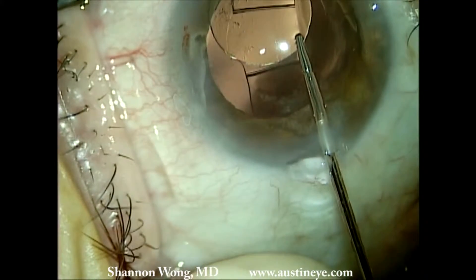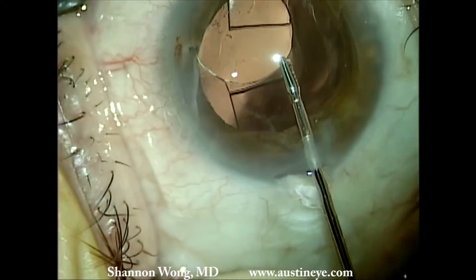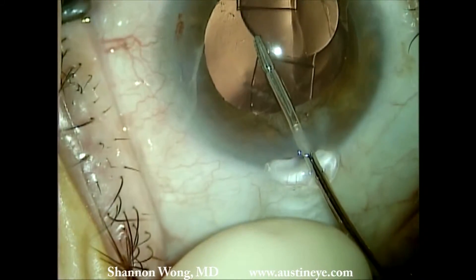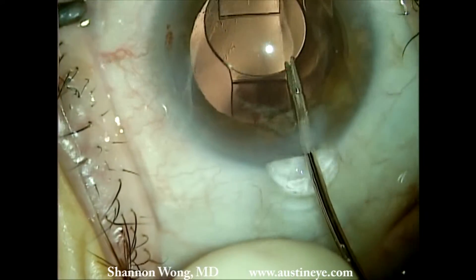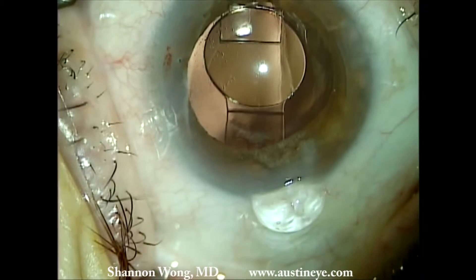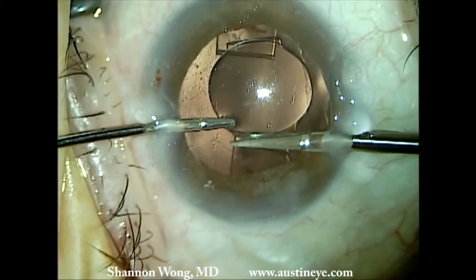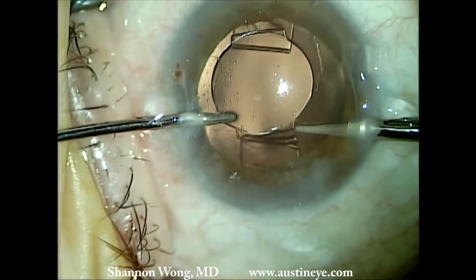We then try to free up the opposite haptic and find that it too is fibrosed into the equator of the capsular bag. So we elect to amputate that haptic as well.